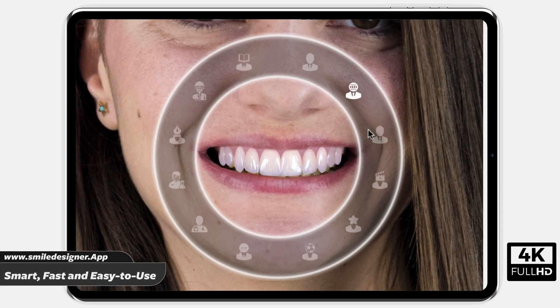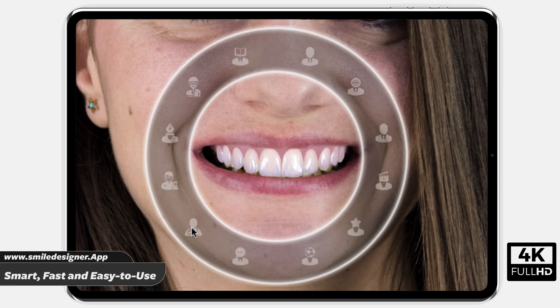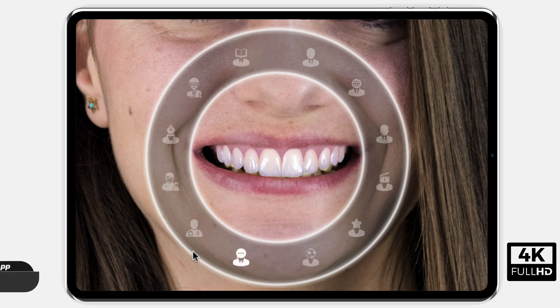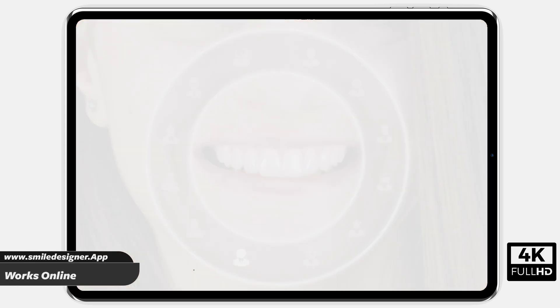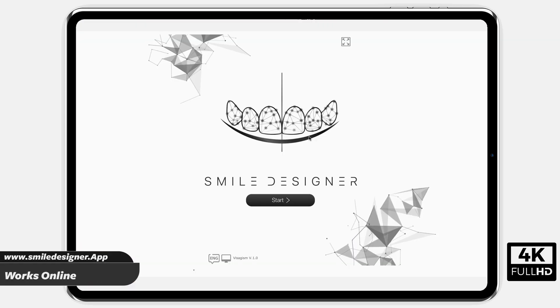Smile Designer App is a smart, fast, and easy-to-use smile design software. The software works online and it does not require downloading.